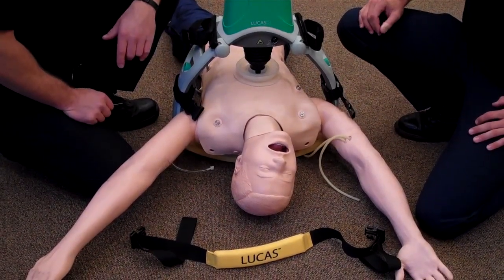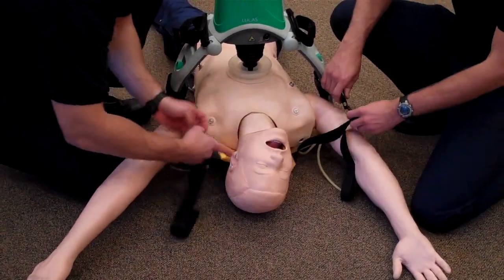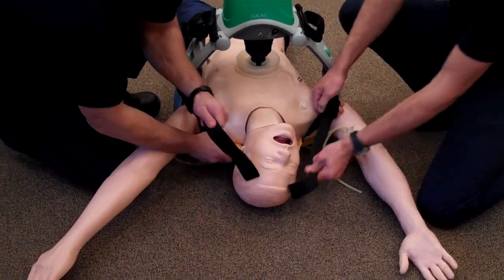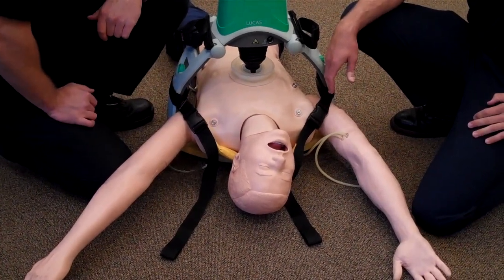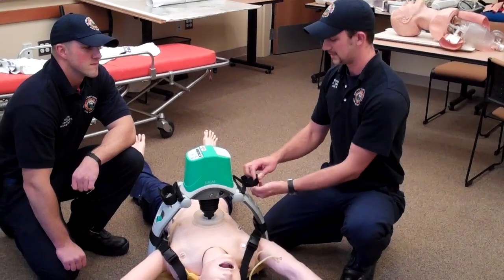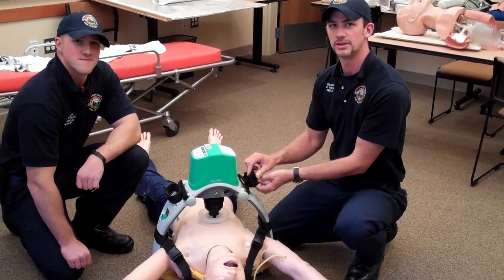While compressions are being delivered, place the strap behind the patient's neck. Connect it and tighten it evenly. This keeps the device from migrating while delivering compressions. On a real patient, we would use the wrist Velcro straps to keep the arms out of the way during compressions.